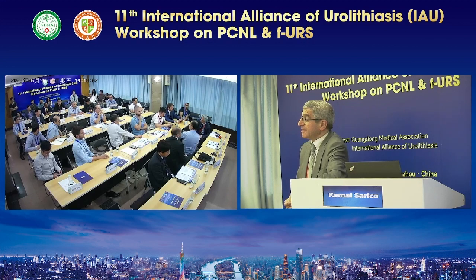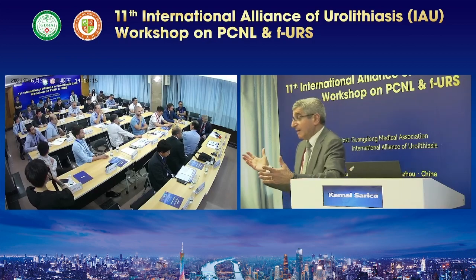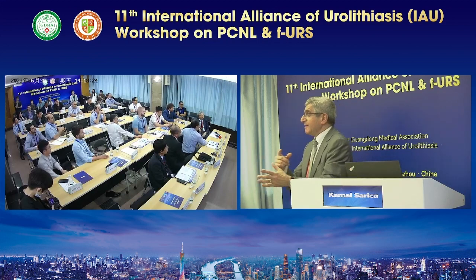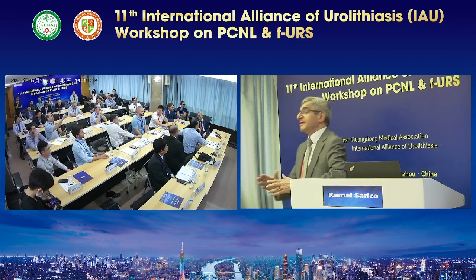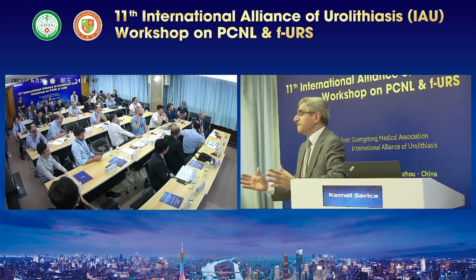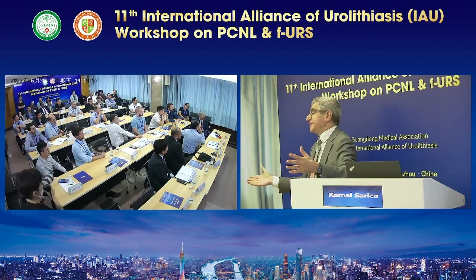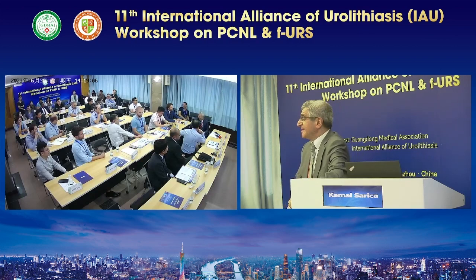Insurance number. Where I come from, for example, we can't afford it. If you ask me the reality, I will tell you the reality, and then I will tell you the dream. Reality is not single use; somehow it is a lowered rate of multiple use. I think the name is disposable scope, not single use. Yes, you are right. I call it a lower rate of multiple use. This is the reality. But the dream is that someday in the future those countries will use it. Throw it away. Oh my God, when? Someday maybe. This is the dream.